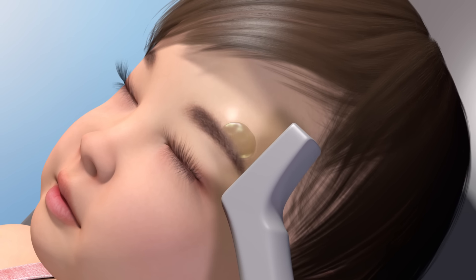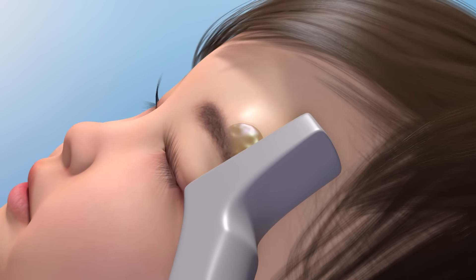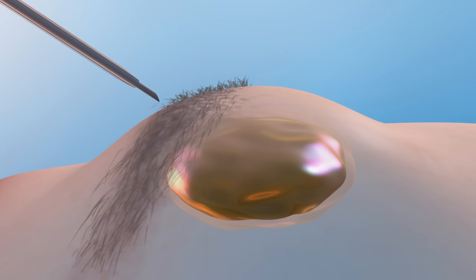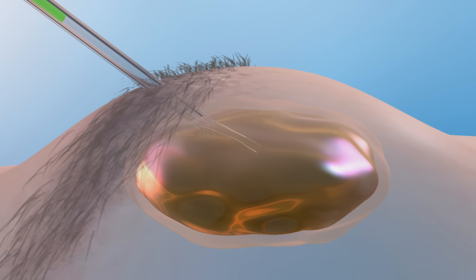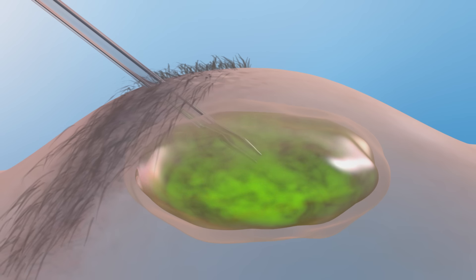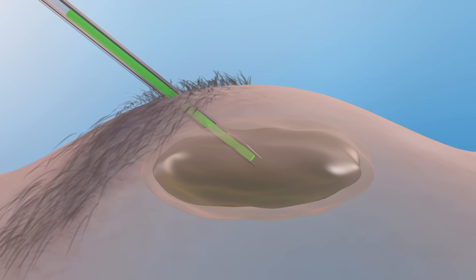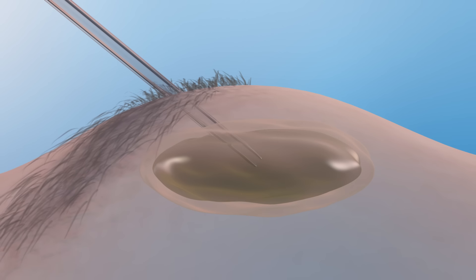Ultrasound imaging is used to guide a small tube called an angiocatheter into the cyst. A medical detergent, Sotradecal, is injected to thin and dissolve the oily contents, allowing the cyst contents to drain.